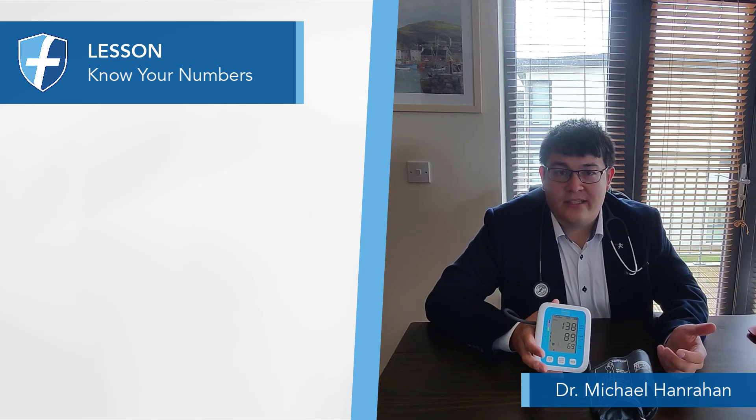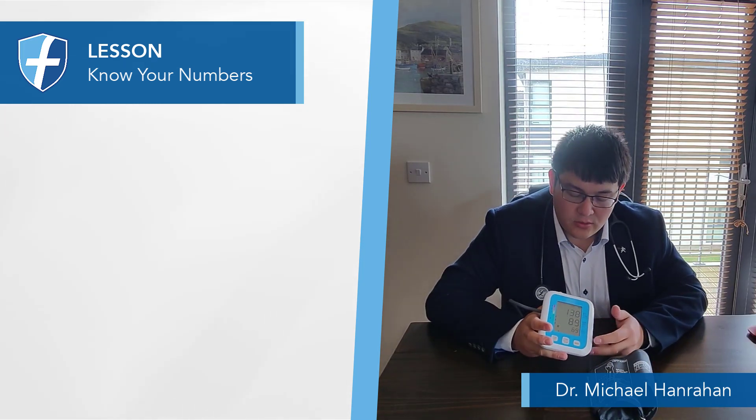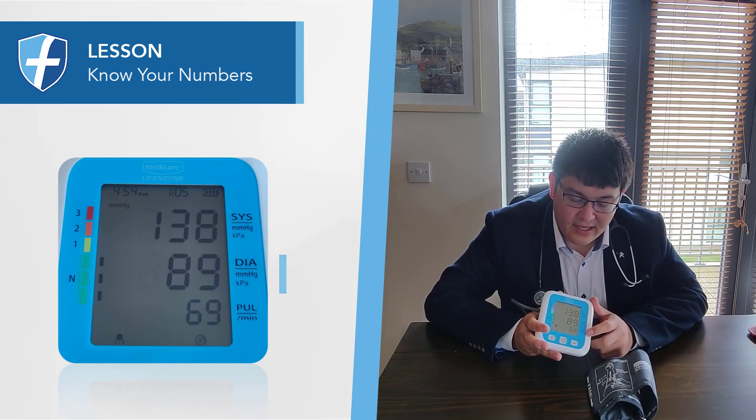When you're taking your blood pressure at home, it's important to know what the different numbers mean. Most blood pressure machines look exactly like this. You've got a systolic blood pressure measurement, a diastolic blood pressure measurement, and your heart rate.